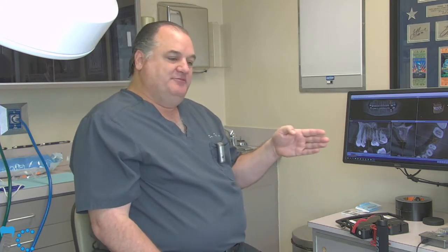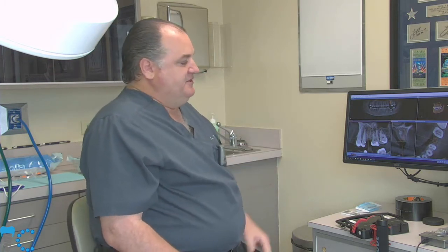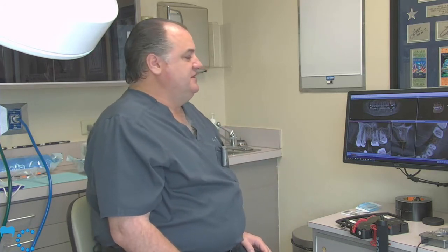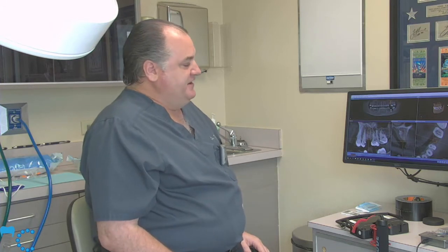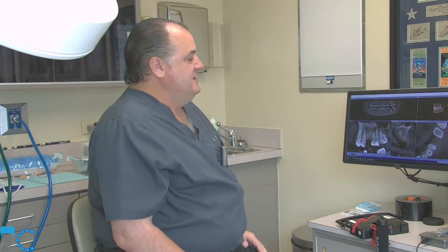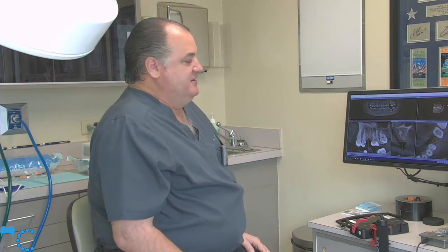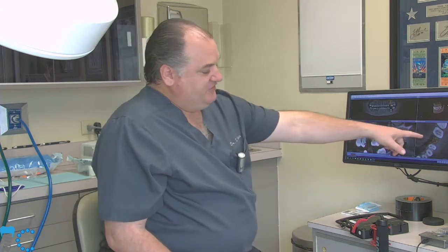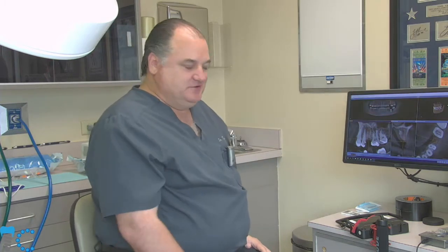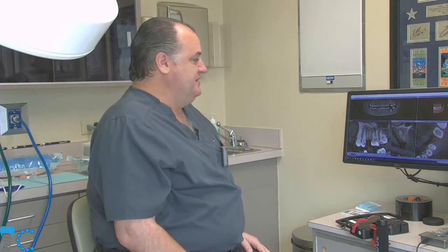So if we don't get our implant perfectly positioned and perfectly angled, the amount of overhang of these crowns can become a real challenge and a problem. So again, surgical guide, I think, is more critical, believe it or not, for molars than it is for anterior teeth. In the anterior, we are obviously using it to make sure that our aesthetic setup is optimal, but for a single tooth implant that's not a distal extension, typically we don't use a surgical guide. So that's what we're going to see today. We're going to freehand our implant placement with no guide.